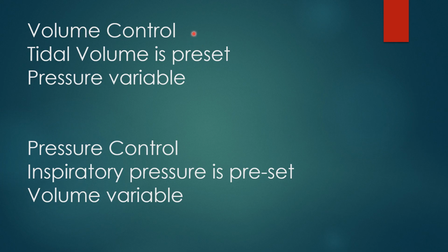So here's the thing to remember about the difference between volume control and pressure control. In volume control, the tidal volume is preset, guaranteed. The pressure is variable. In pressure control, the pressure is preset and the volume is variable.